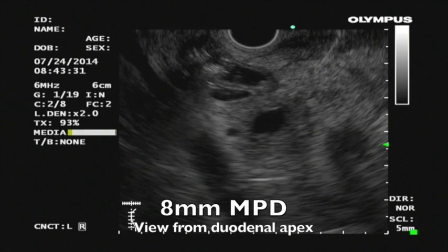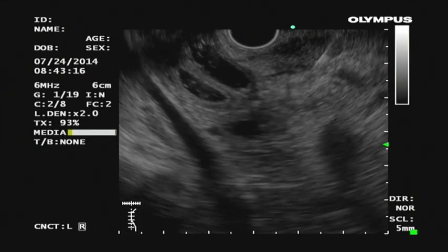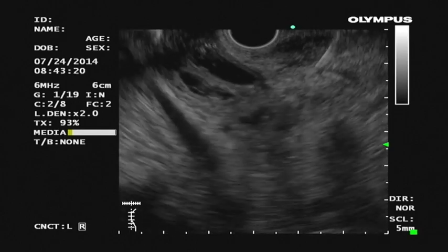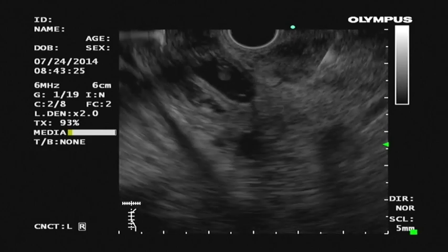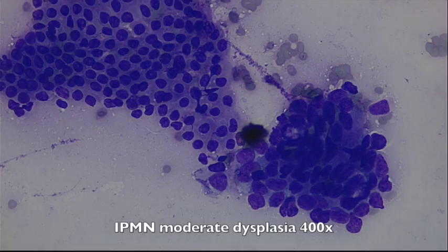The pancreatic duct measured 8 mm in the head of pancreas, and a decision was made to sample the hypoechoic periductal tissue. 3 passes with a 25-gauge needle from the duodenal bulb were made. This was diagnosed as IPMN with moderate dysplasia.